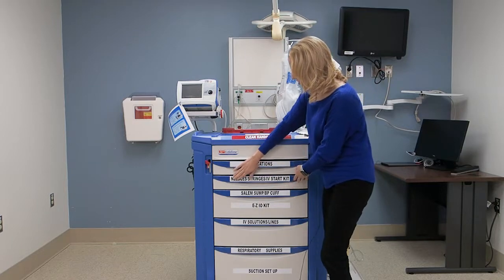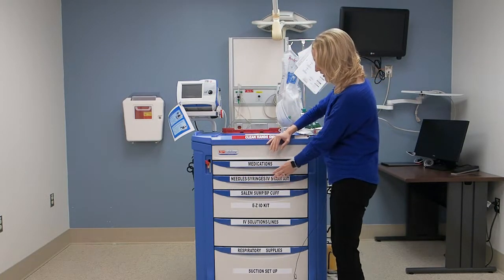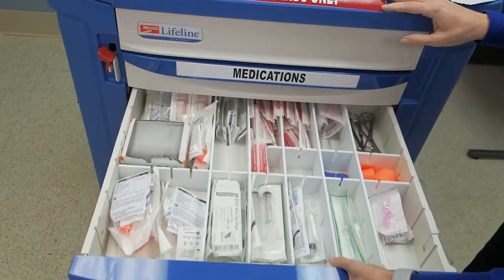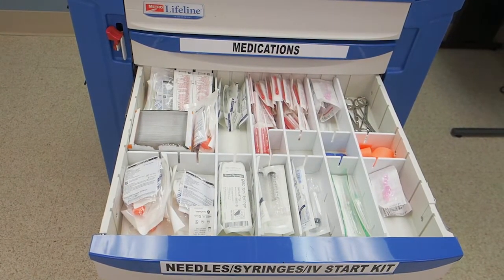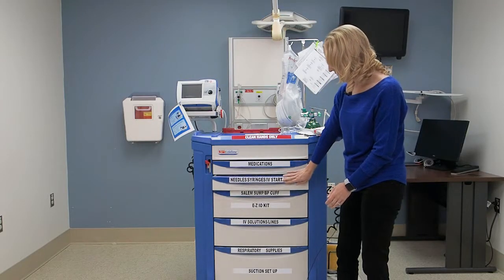Moving down, just as labeled, you're going to see your needles, syringes, and your IV start kit. This is where all of your sharps and items like that are going to be located. You'll find your IV start kit, your syringe, your IV catheters, your blunt tip needles, some scissors, and then you will also find alcohol wipes as needed, just like it says.